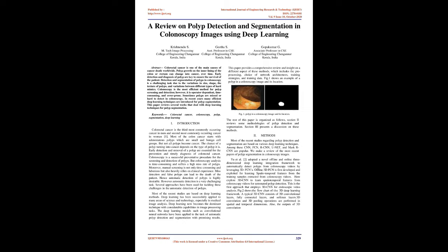Colonoscopy is a successful preventative procedure for the screening and detection of polyps. But colonoscopy analysis is time-consuming and suffers a high miss rate of polyps. Moreover, manual screening is not only time-consuming and laborious but also heavily relies on clinical experience. Misdetection of polyps can lead to the death of the patient. Hence, automatic detection of polyps is highly desirable. However, automatic detection is a very challenging task.